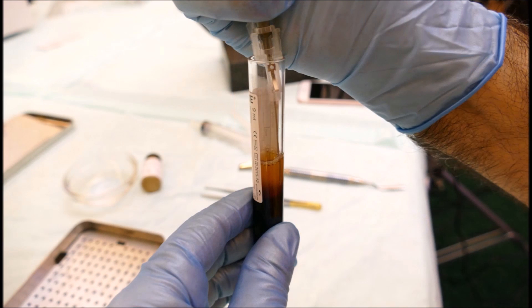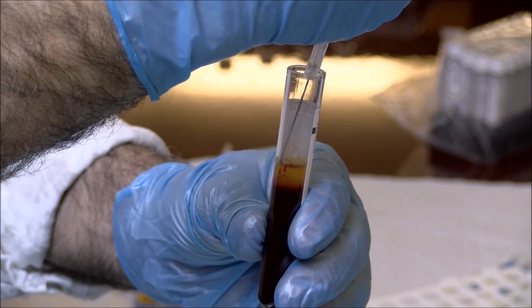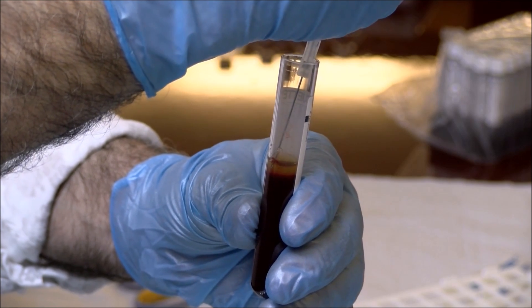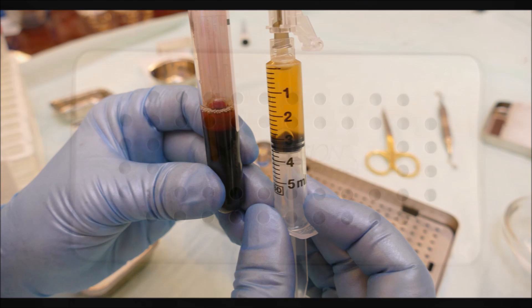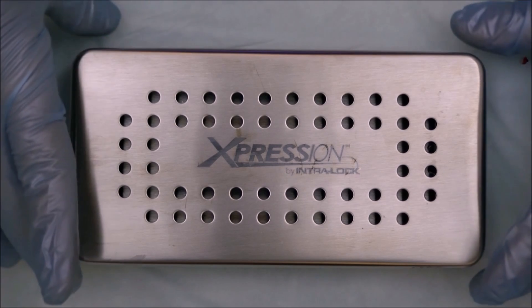A sterile syringe is then placed in the plasma zone, and the plasma is very carefully harvested. The plasma is then set aside while we complete fabrication of the PRF membranes. The red top tubes continue to spin for an additional nine minutes.